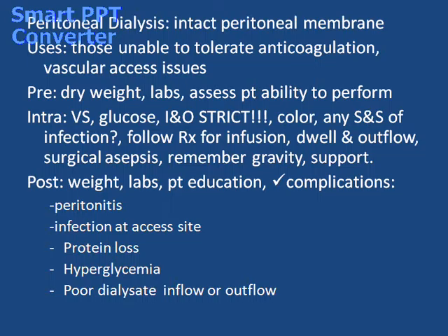We follow the times of the infusion, the dwell, and the outflow very strictly. Maintain surgical asepsis during this procedure of the catheter insertion site and when accessing the catheter. We're going to definitely keep the outflow bag lower than the patient's abdomen. We want to talk about gravity. It drains by gravity. We don't want any reflux.